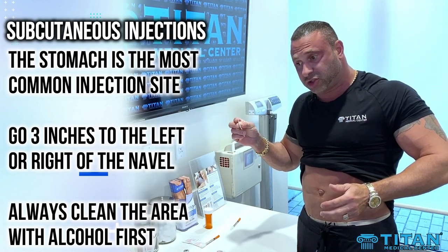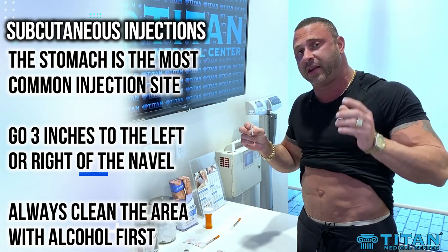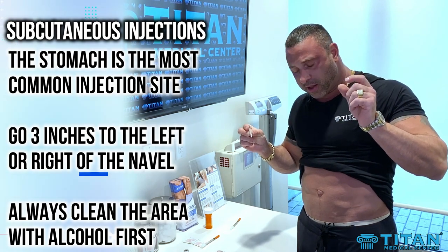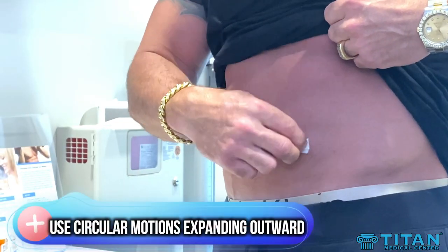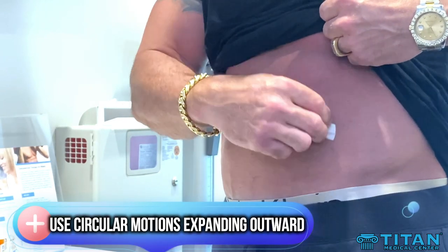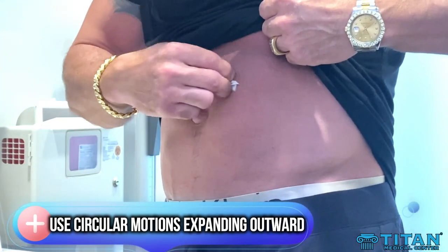I'm right-handed, so I'm going to hold the needle with my right hand and I'm going to pinch some skin on my left. So let me clean the area. I'm going to go in and start in a little circle and work my way out, pushing the dirt away.